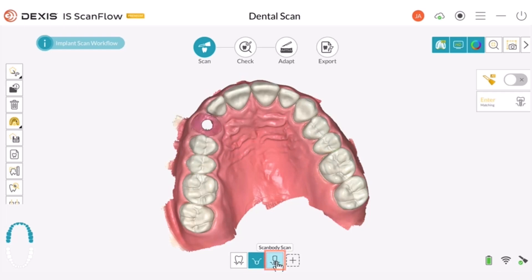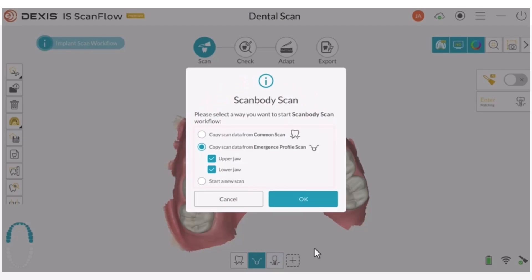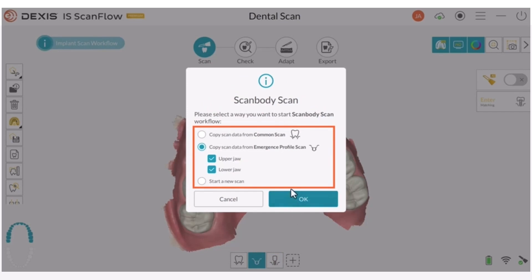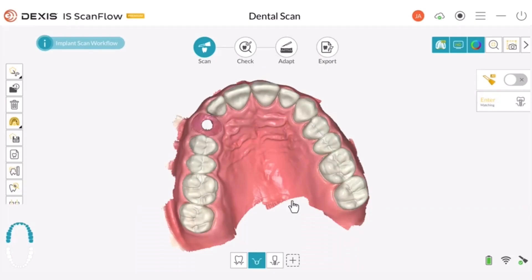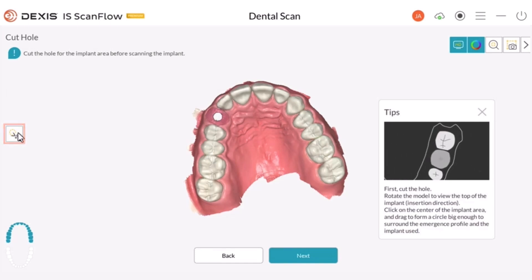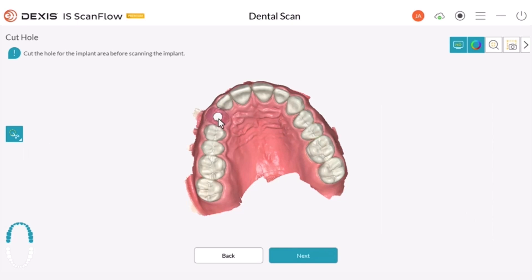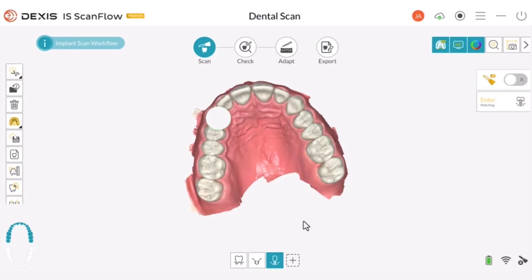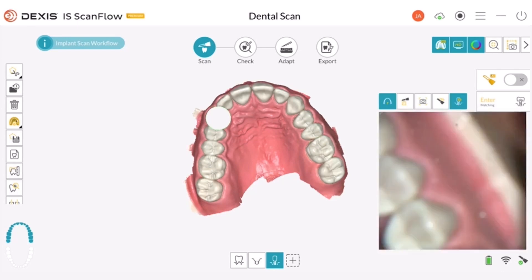Scan Body Scan. After placing the scan body, re-scan the area.